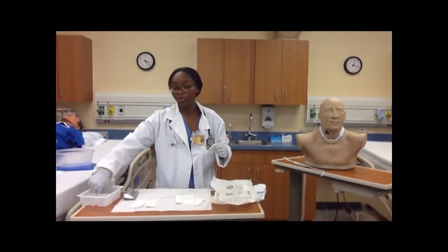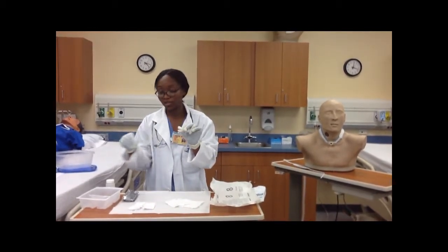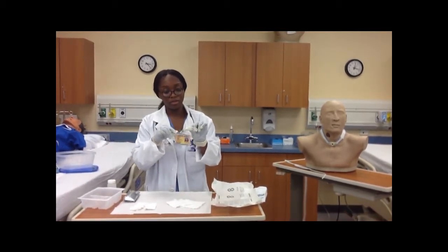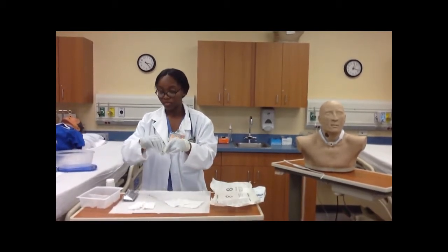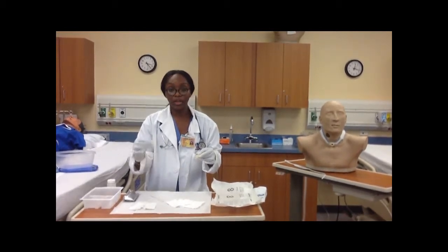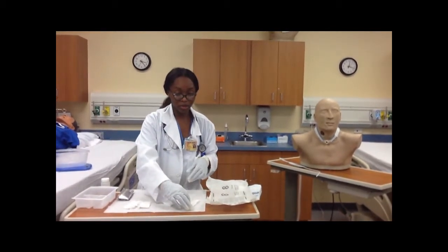And now I can remove my inner cannula. I let it sit for a little bit so that it can dissolve any type of mucus that's on there. And I'll just clean the inside of it, clean around it. And now I'll dip it into the saline water solution. Shake. Dip it into the second water. Shake. And I set it down on this gauze so it can dry.